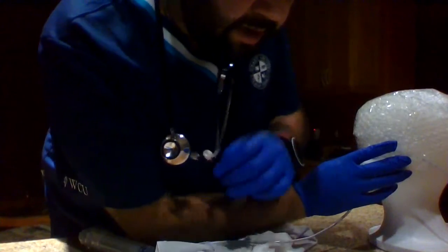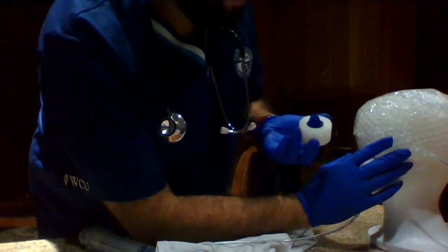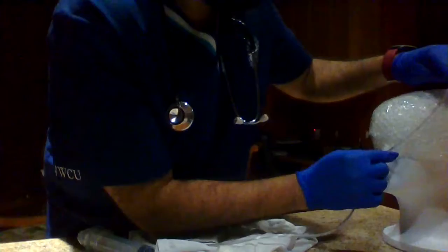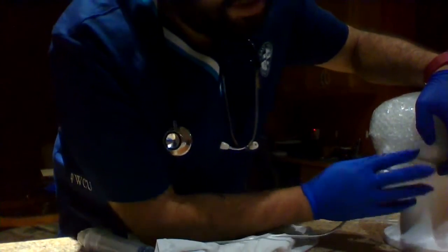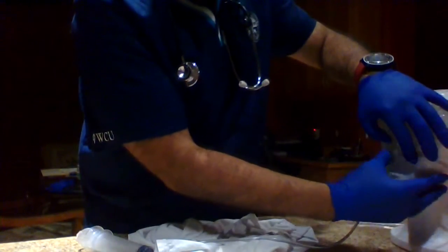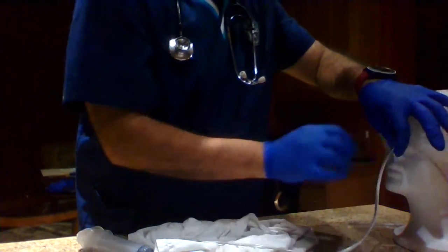So now we have to secure it there. Usually I would have a free hand, so it would be a lot easier. We would secure it in place here. There are two ways of securing it. The easiest is just doing it on top of there. Again, you have it there, you secure it. You have to be sure this tube is not touching the inside of the nares.